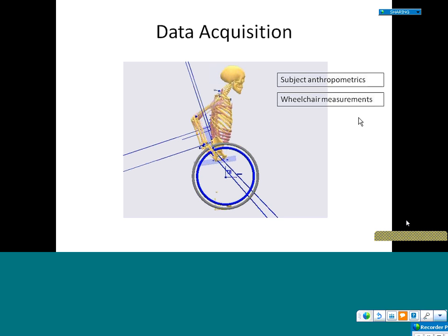I'm collecting 3D kinematics from each subject, and I'm doing that from the Vicon motion analysis system. So I have reflective markers on upper body bony landmarks, and I have the 3D trajectory of these markers throughout space, and I'm using that to drive the motion of the model.